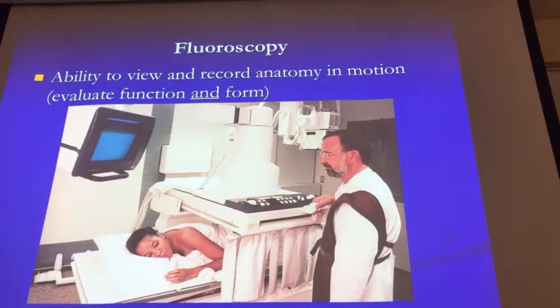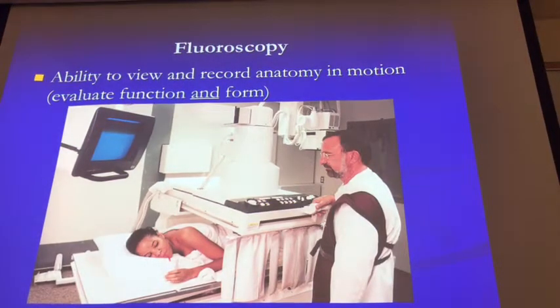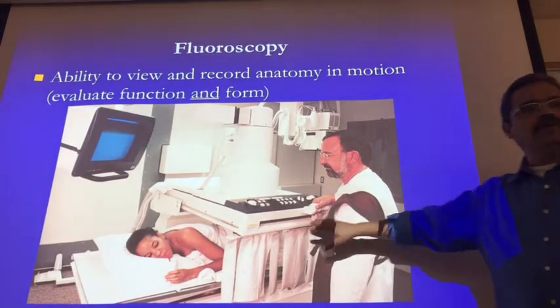So with fluoroscopy, you're going to have different types of equipment. How many of you have done fluoroscopy so far? Okay, most of you have. And those of you who haven't, you will. The time will come. Maybe at the hospital where you are, the days you are there, they don't do much fluoro. But once you become a second-year student, you'll get plenty of fluoroscopy. We don't do as many fluoroscopic exams as we used to. It has decreased a lot because of CT, ultrasound, and MRI. Now, not every person is a candidate to have those exams, and so we still rely on fluoroscopy.